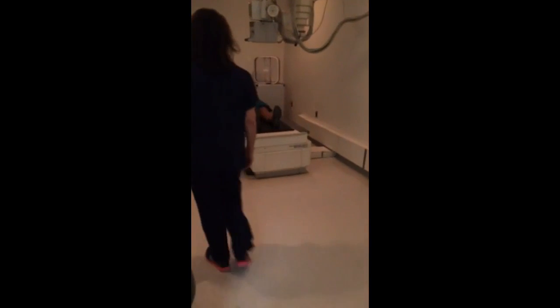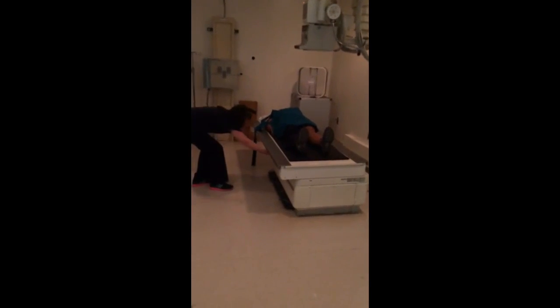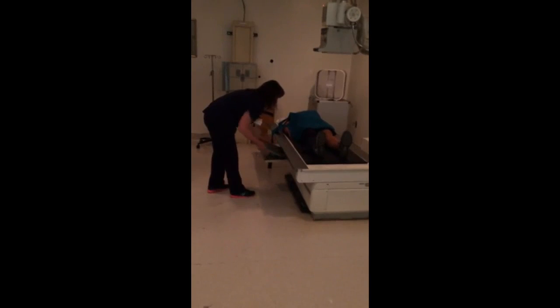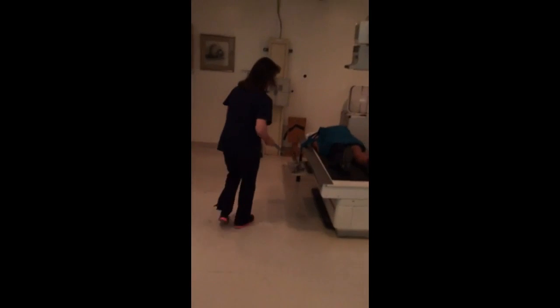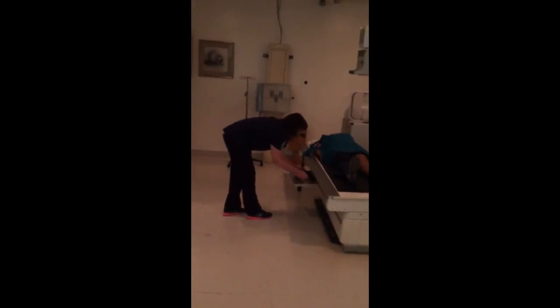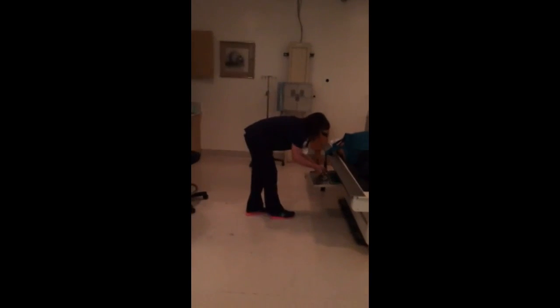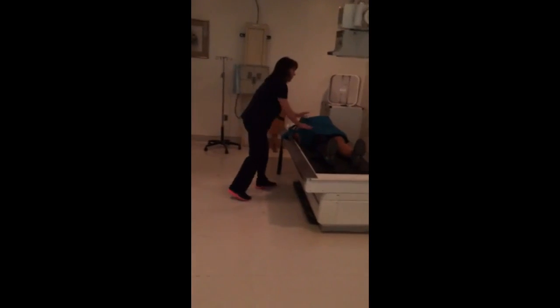All right, I'm going to go ahead and take my exposed IP out of the bucket. Place it off to the side. Grab a new, clean IP. Insert it back into the bucket. Line it up. Patient shielded.